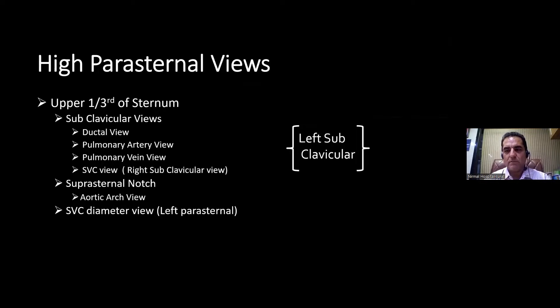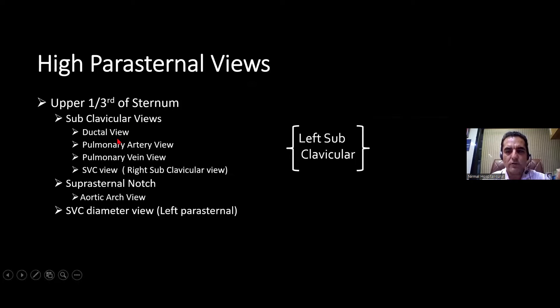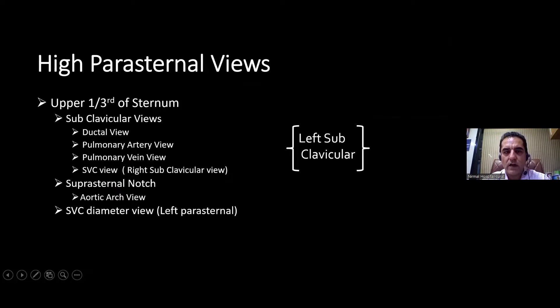High parasternal views — also called subclavicular views — are obtained in the upper one third of the sternum, above the nipple line. The major views included are: in the left subclavicular region, the ductal view, pulmonary artery view, and pulmonary vein view. We also perform the SVC view, looking for the SVC entering the right atrium, and in the suprasternal notch we visualize the aortic arch.